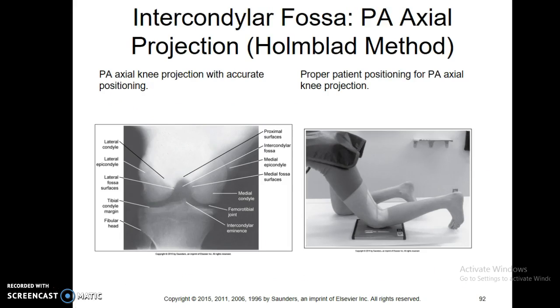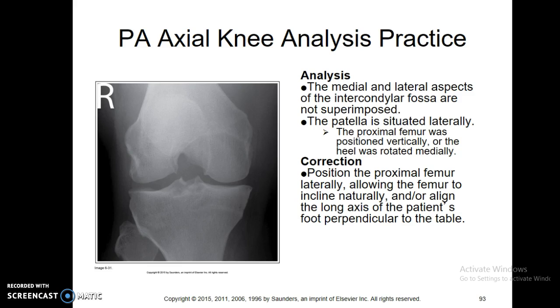Intercondylar fossa, the Holmblad method. I would just extend the foot out a little bit. Generally, I don't like it out like this. Just bring this straight out, so no dorsiflexion in that foot. We'll kind of relax the patient a little bit more.